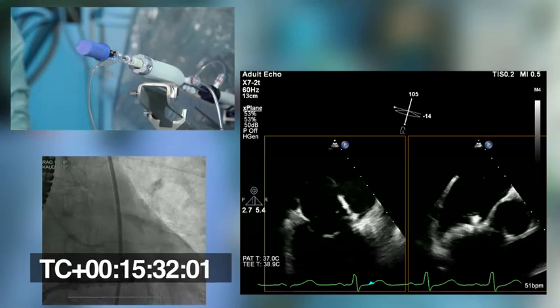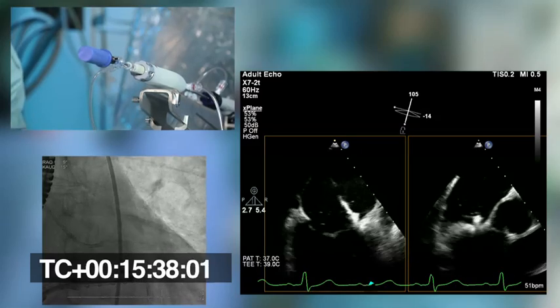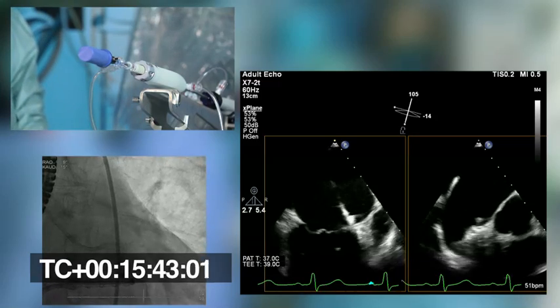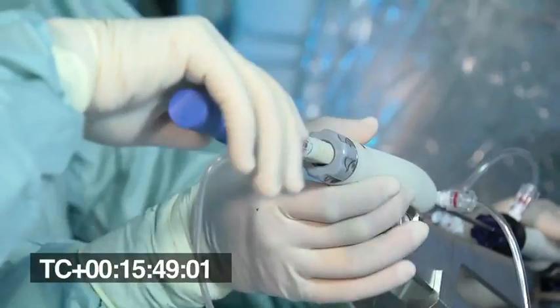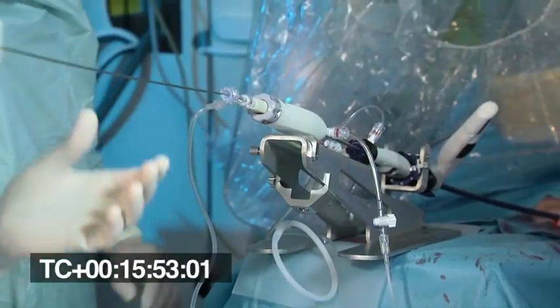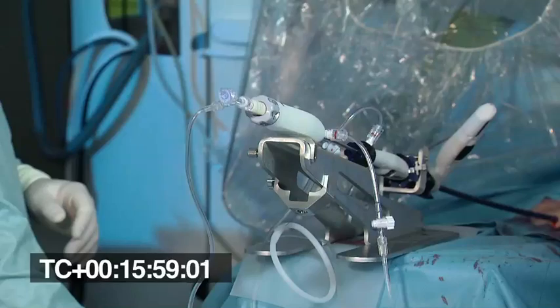On 2D we see we are a little bit probably too shallow, so I will contract the delivery a bit to be more perpendicular. Being more perpendicular is good at this time because we don't want to get into the circumflex. We do another pull test and they move together — it's pretty strong, so the second anchor is also good. Before we deliver, we release and just check that the leaflets are moving freely and that we didn't hit the leaflet. The leaflets are fine.